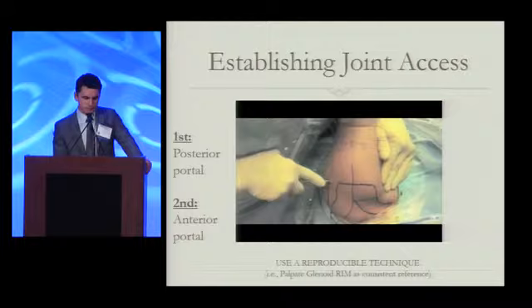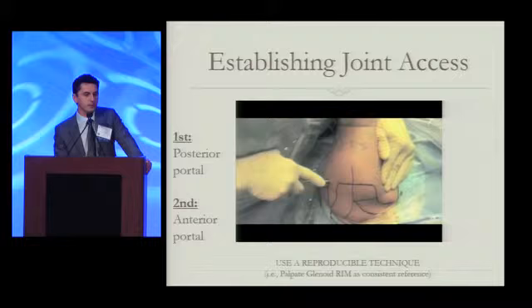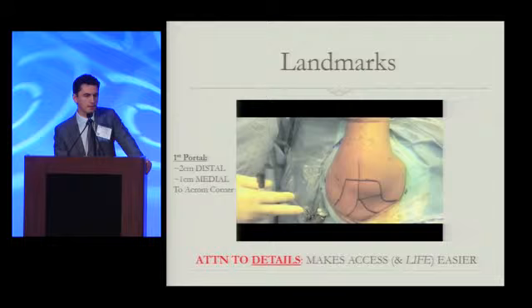So, let's go back. So our landmarks, first portal, is going to be approximately 2 centimeters distal and 1 centimeter medial. Can we play that video? Can you guys click play on that video?